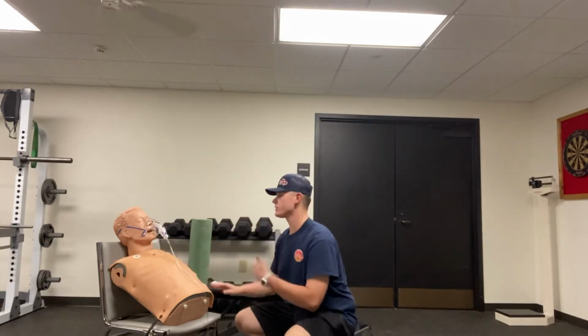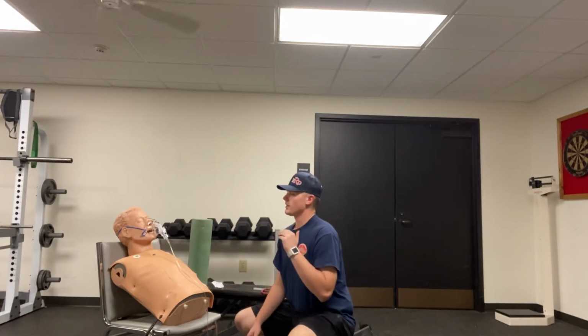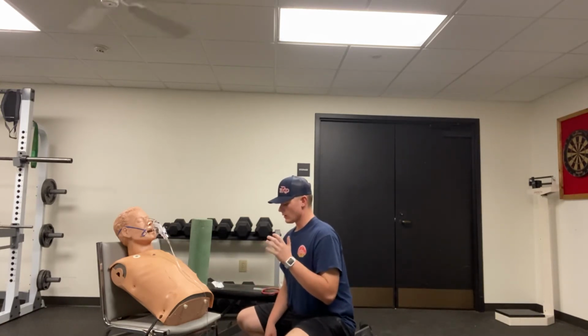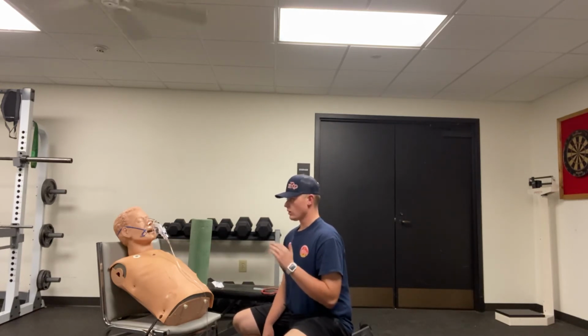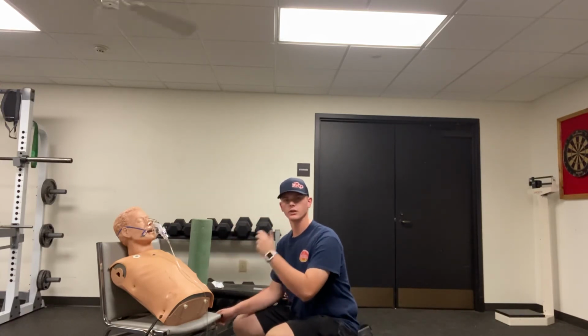I'm going to coach the patient. Sir or ma'am, could you just follow my breathing? Deep breath in, deep breath out. Breathe through your nose, breathe out. In through your nose, out through your mouth. I will continue to coach this patient whenever needing to do so. I will let this patient breathe in all the fluid of Atrovent or albuterol.